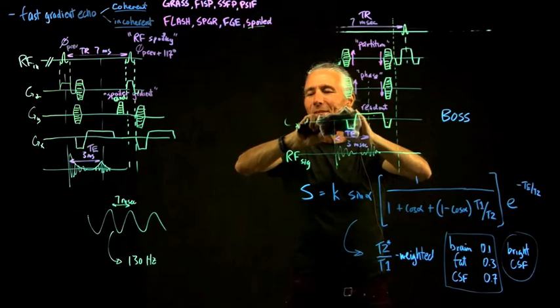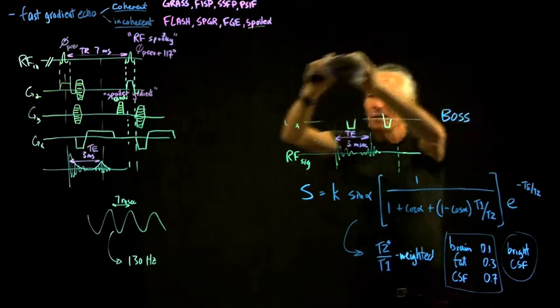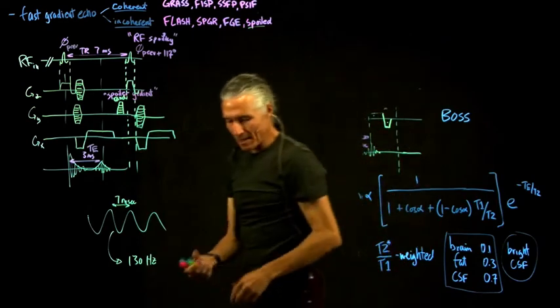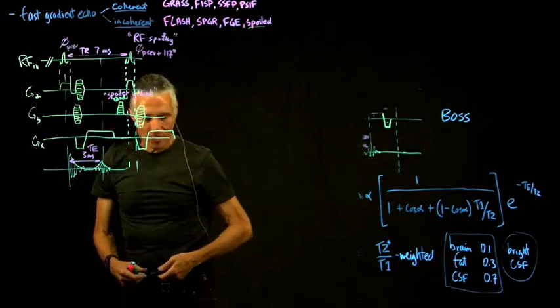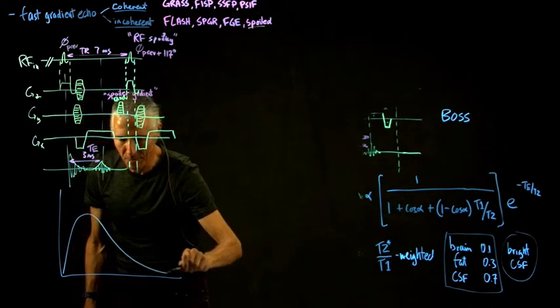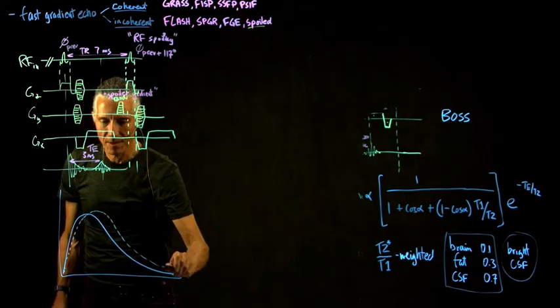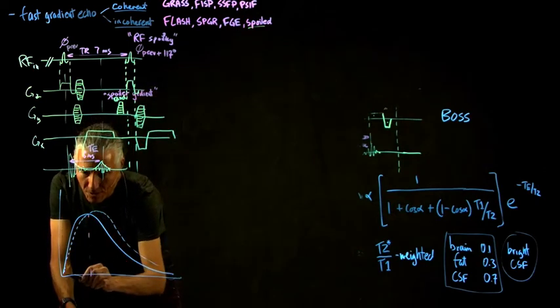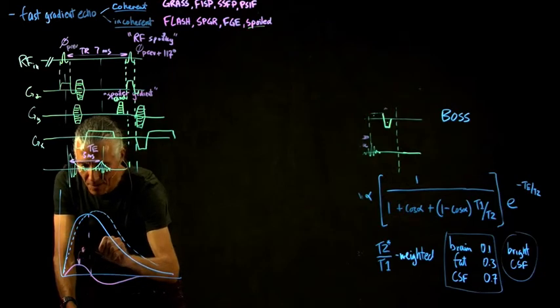But there's still a good 25 minutes to say what we actually do. So that one, you can get pretty good T1 contrast with this. This is the one that we went over the actual equations for, so that was in the homework. If you plot that graph, you get something like that for one tissue type, and another tissue type might be something like this. If you subtract the two, you'll get something that goes through 0 here. So it goes up and then it goes down, something like that. So that would be the diff.